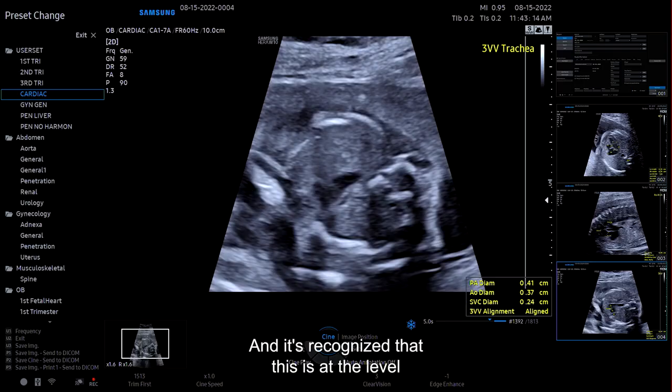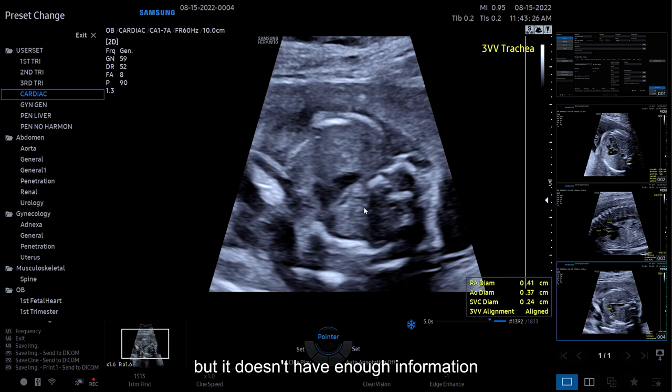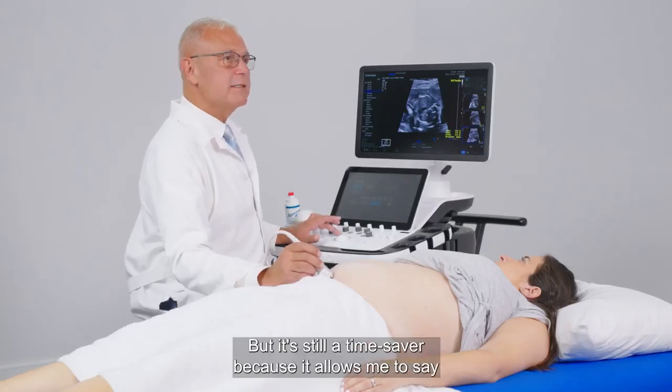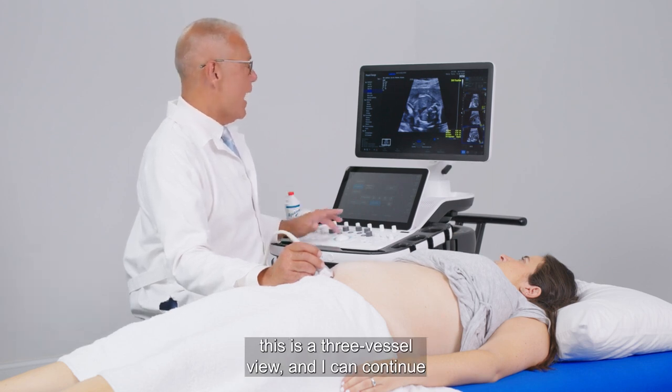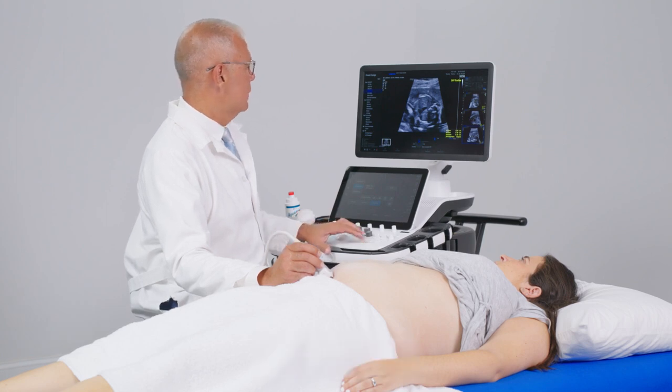And it's recognized that this is at the level of a 3-vessel view, the tracheal view, because you can see that there's the trachea as well as the esophagus being visualized on the screen. But it doesn't have enough information to label the actual components of it. But it's still a time saver because it allows me to say this is a 3-vessel view, and I can continue to the next view that I need in the process.